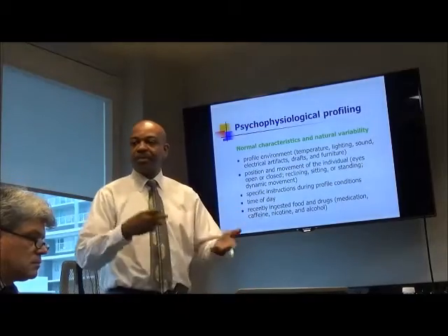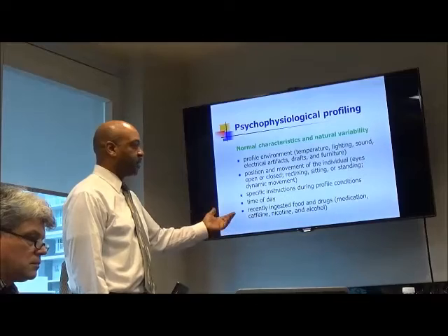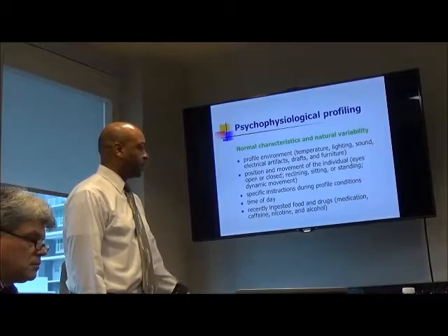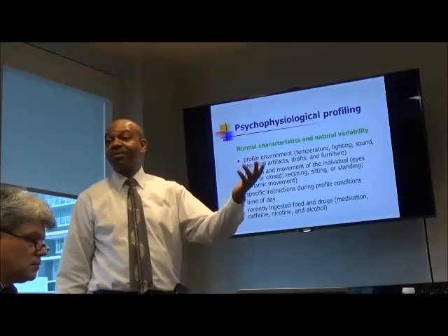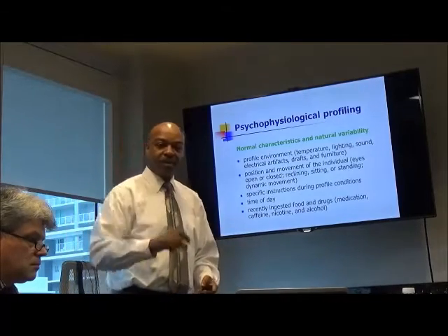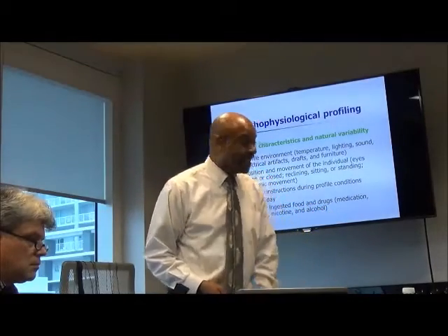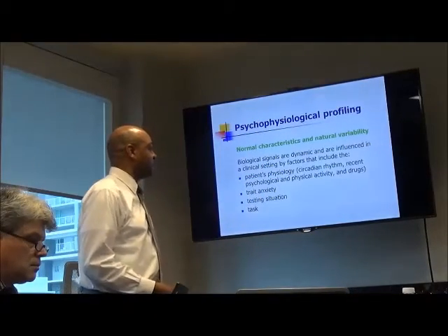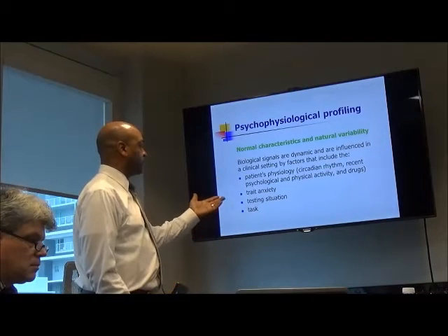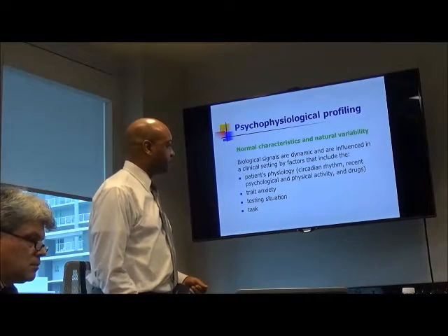So, with people with their internal clocks and so on, and how it can affect their body, their mood, and so on. What the person ate recently, if they just smoked a cigarette, those things can definitely affect it. Or if they just had one of our coffees here. Or if they came in drunk, all of these things are important. And these are other things that can influence what happens with the test.